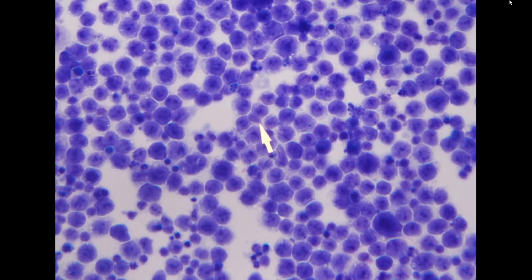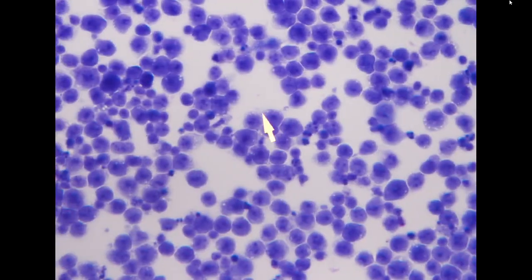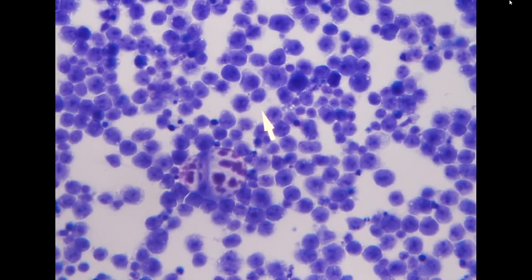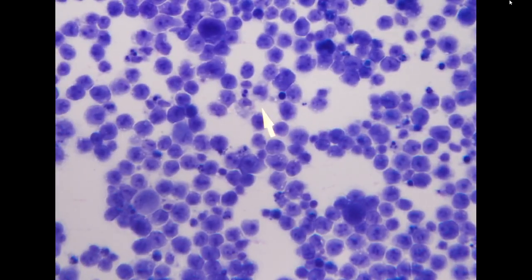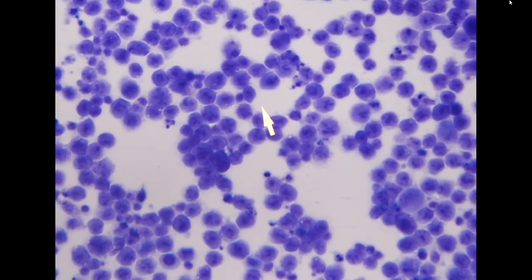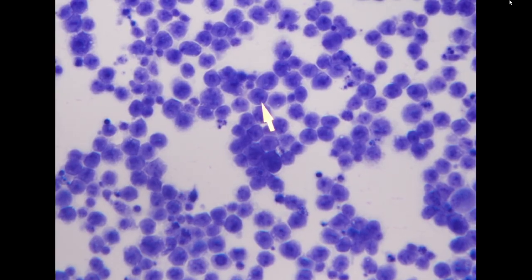And we also see the cytoplasmic basophilic rimming, like basophilic granules inside the cytoplasm, which suggests it is of lymphoid origin. So this is compatible with large cell lymphoma. For primary effusion lymphoma, the differentiation is B cell, but it is a terminal differentiation of B cell, so it won't express the common B cell markers such as CD20 or PAX5.